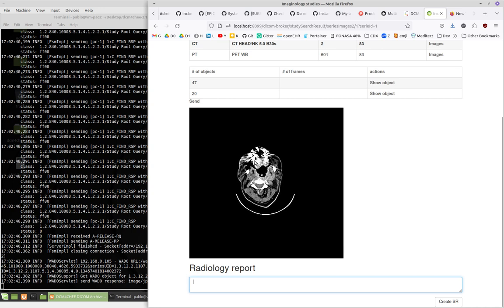So the image you see these kind of sparks is because it's reflecting from the teeth that are fixed.